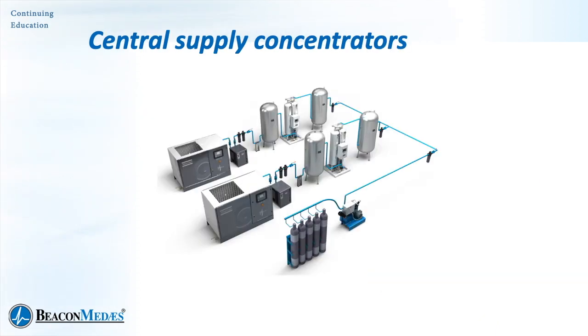And up from there, we have the full hospital systems. These are designed to produce oxygen for use in an entire pipeline. They are multiple sourced, and they comply with one of the medical gas standards. Usually in the United States, it would be the NFPA 99. In Canada, the CSA Z7396-1, or the ISO 7396-1.